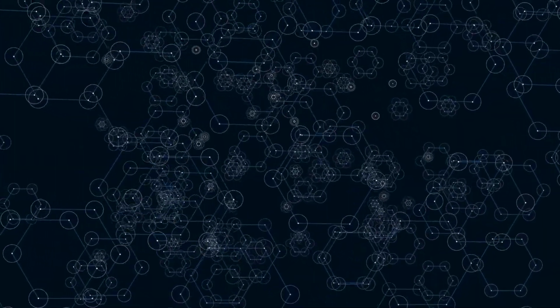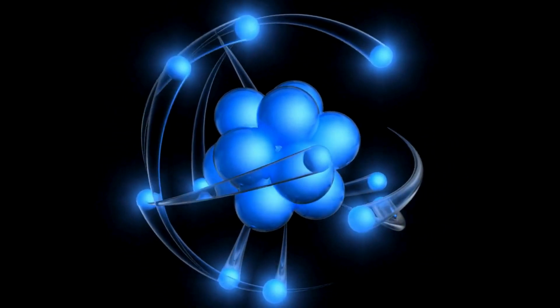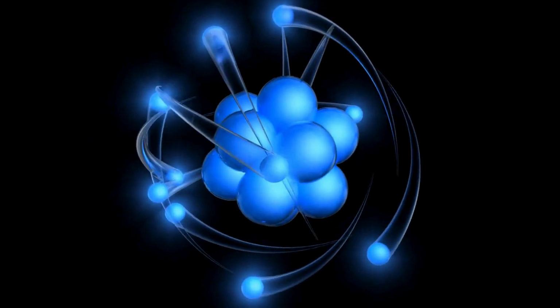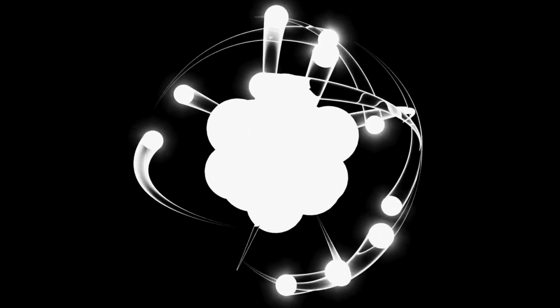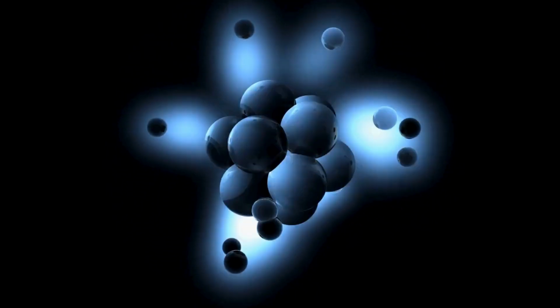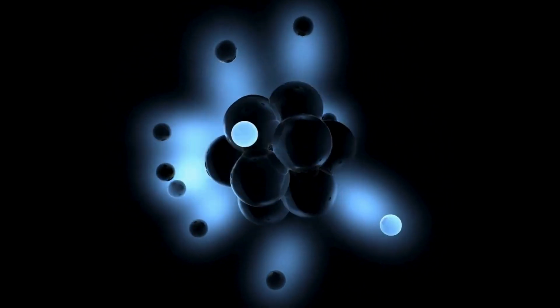Our bodies are made mostly of water. Each molecule of water consists of 2 hydrogen atoms and 1 oxygen atom, and every hydrogen atom has a single proton in its nucleus. These protons are the key to how MRI works. While this may sound like high school chemistry, don't worry, it will all make sense in a moment.